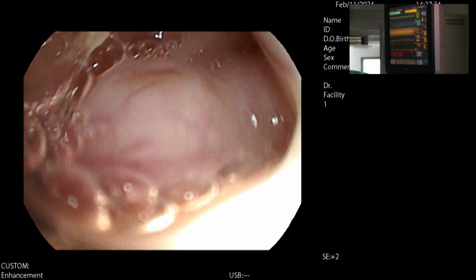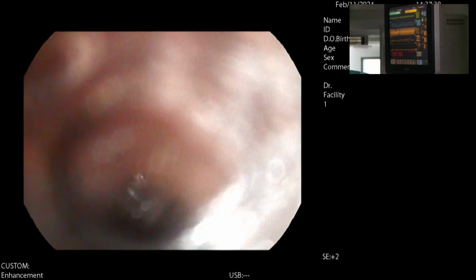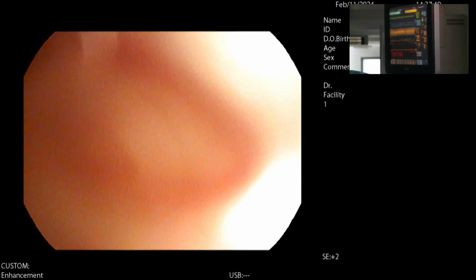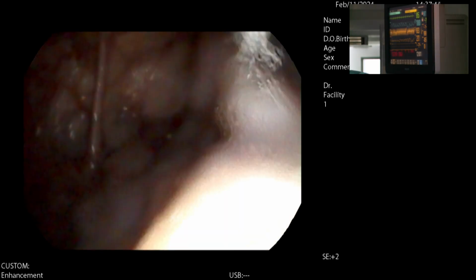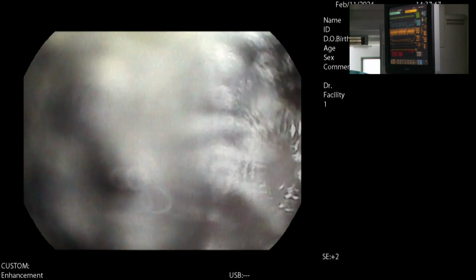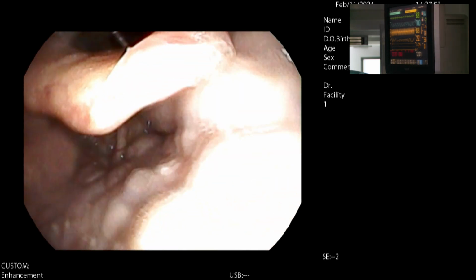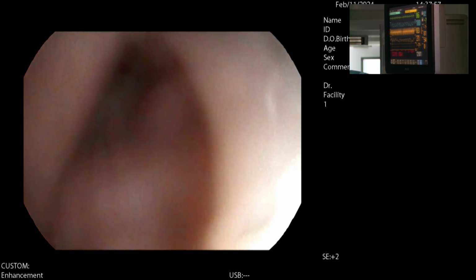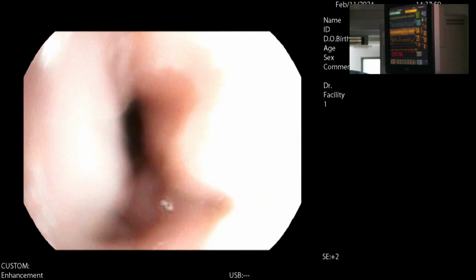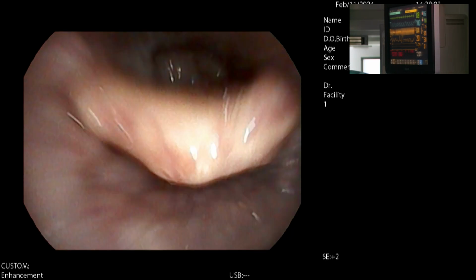Oh, jaw thrust maneuver, please. You are doing a jaw thrust maneuver to open up the airway to see the effect of the jaw thrust maneuver there. Very severe collapse. This is at the level of velopharynx, oropharynx now, and you can see even the collapse at the hypopharyngeal level.